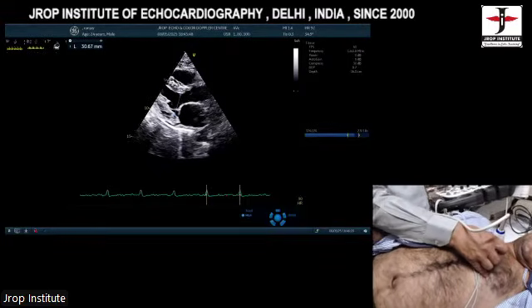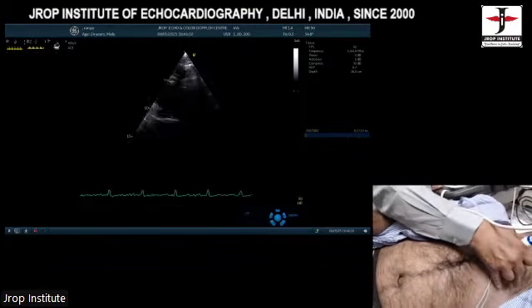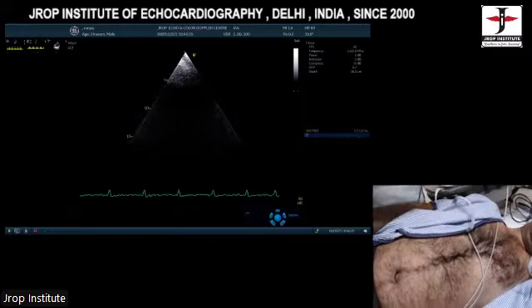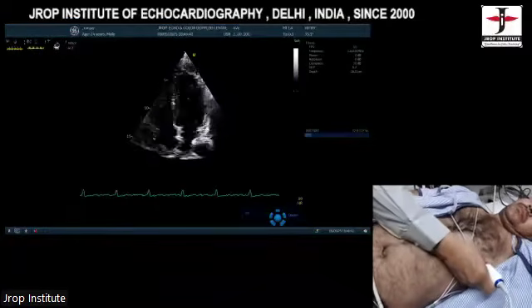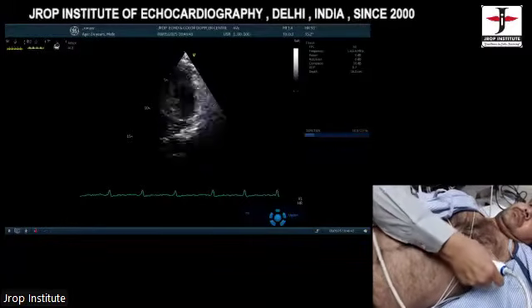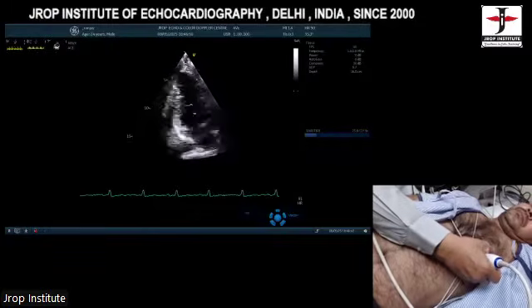So this is end systolic and diastolic dimensions. Now, where to look for my pulmonic blood flow samples? 4-chamber is good for mitral. 5-chamber is good for aortic. Another focused RV view is good for tricuspid valve. Rotate to 3-chamber view, we'll get again aorta and mitral valve.